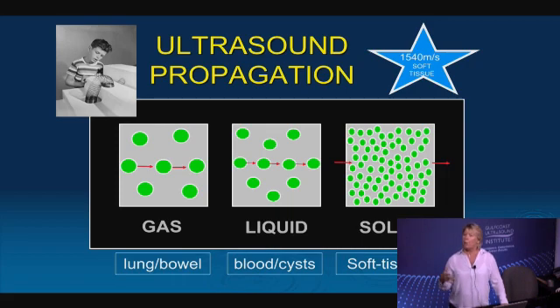And then depending upon what we're looking at, we have normal characteristics. So the first thing is, we've got to learn what normal is. What's a normal liver? What's a normal aorta? What's a normal kidney? What does normal vasculature look like? And then based on what you see on the image, if it's different, you automatically know that's not normal. You might not know exactly what it is at this point, but you'll know that now I need to look at my differentials that fall into this abnormal category based upon what grayscale these structures have been assigned.